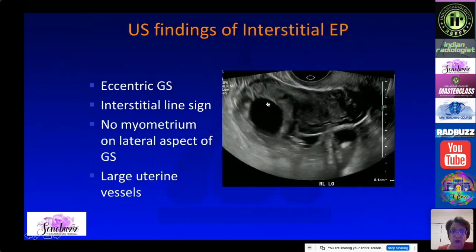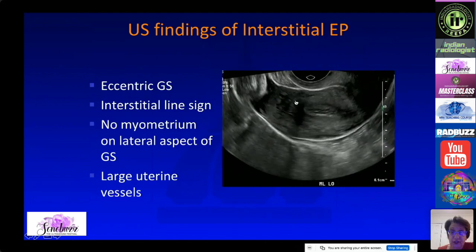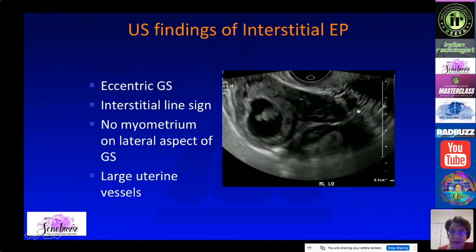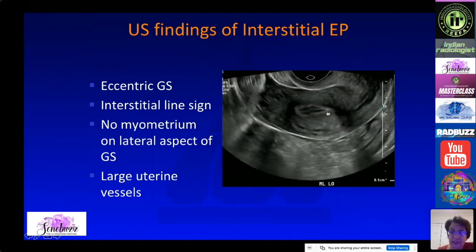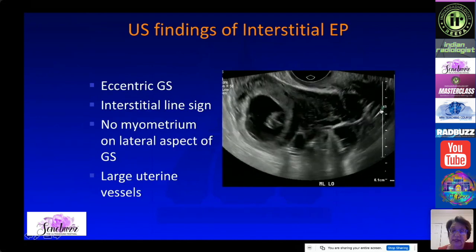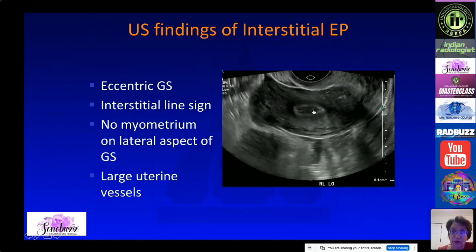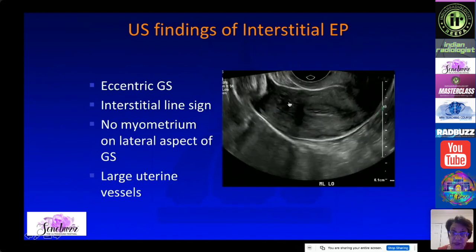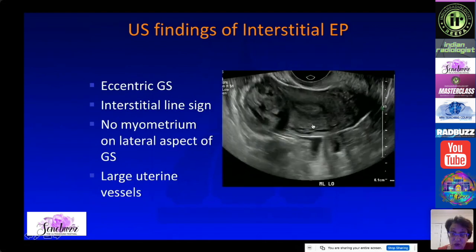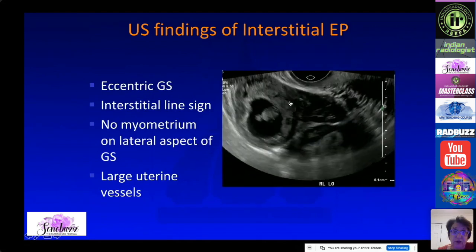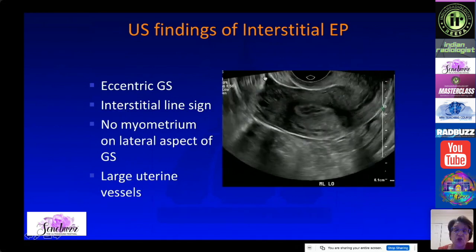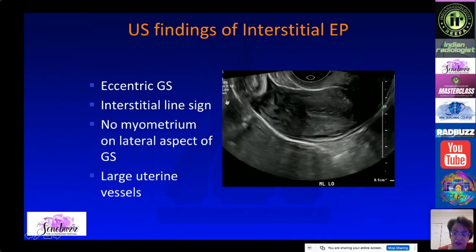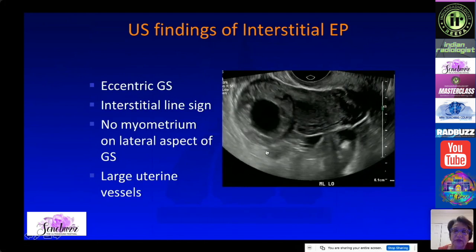The key findings are an eccentric gestational sac and the interstitial line sign — you can see the endometrium extending as a line toward the gestational sac at the cornual portion. There is no myometrium on the lateral aspect of the gestational sac, and you can see very large uterine vessels in this area.